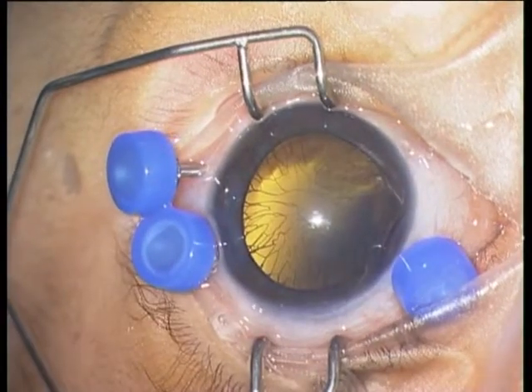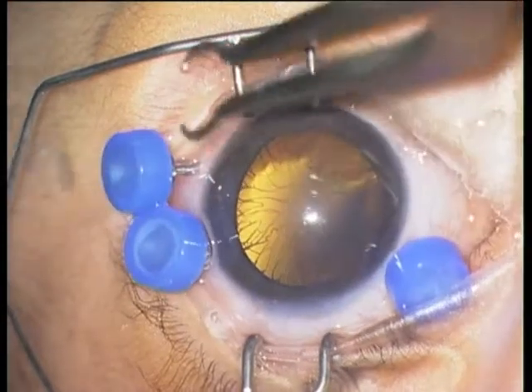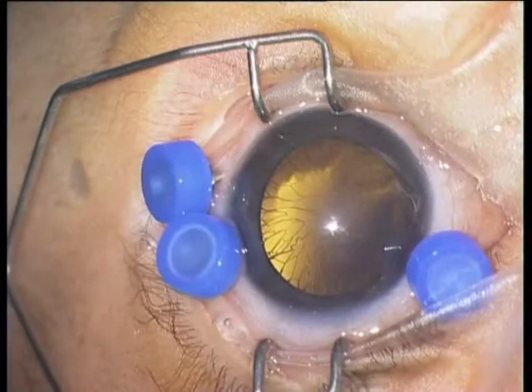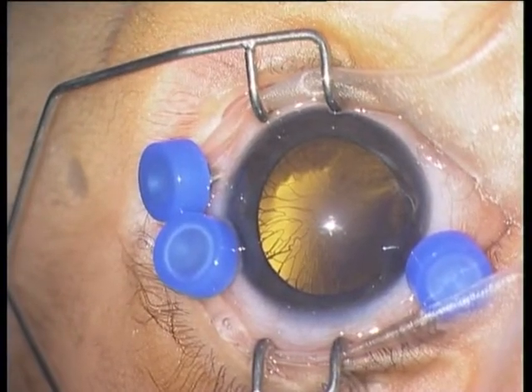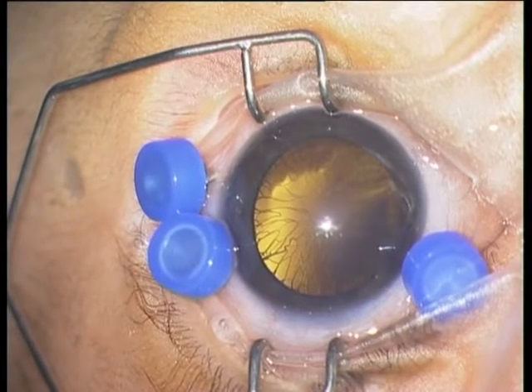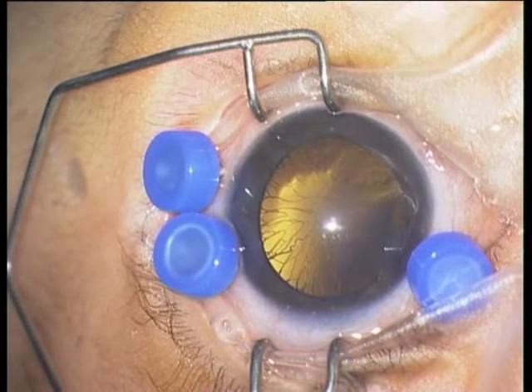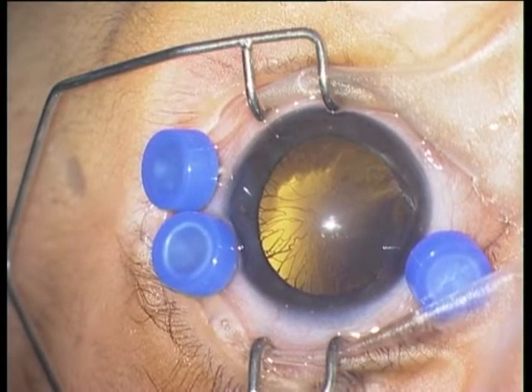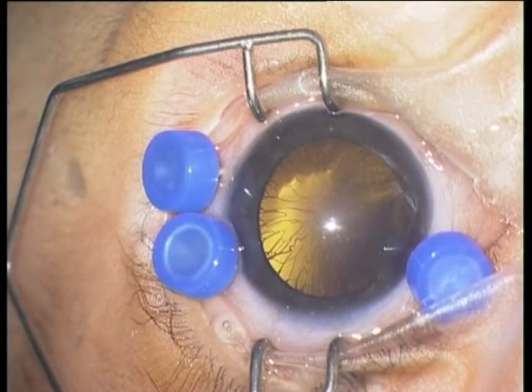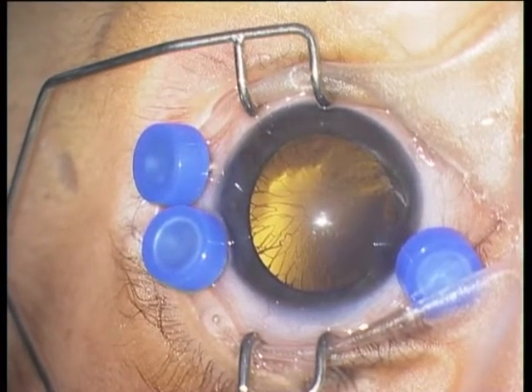The most important thing in this surgery is to have zero complications. If you touch the retina and induce a break, you will have a detachment and blindness. If you have a lens touch, you will have to remove the lens and will inadvertently cause amblyopia. So the surgery is actually very easy, but with zero tolerance for complications.